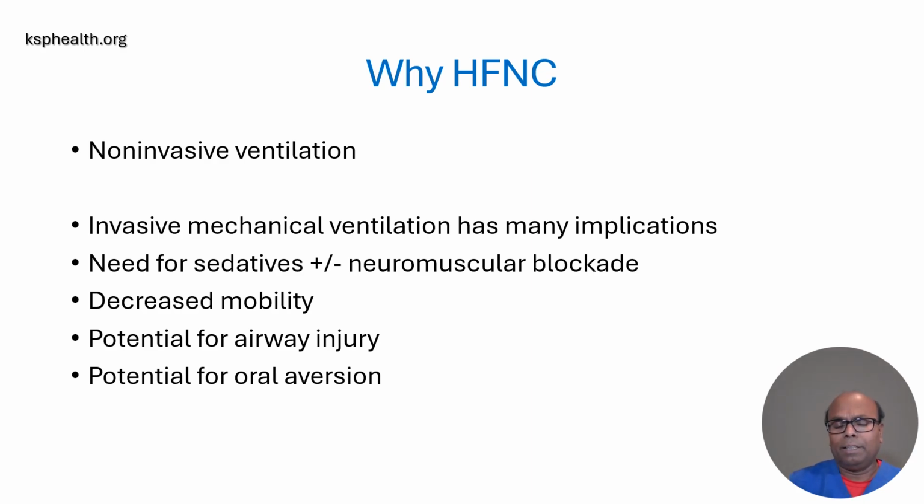As a result, they don't eat by mouth, they develop oral aversion, then you need to have a speech and swallow evaluation before you let them eat. Then they toss and turn if you sedate them a little bit lower than deep sedation. As a result, they tend to have airway injury, and so on and so forth. The high flow nasal cannula avoids all those complications.